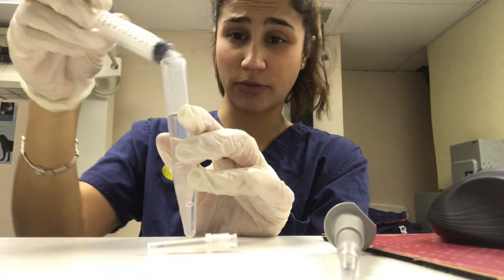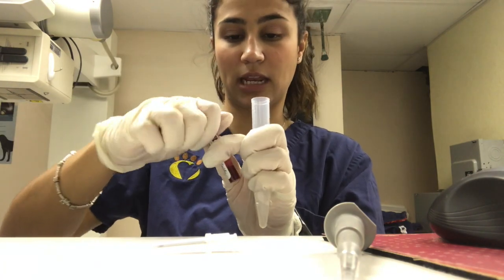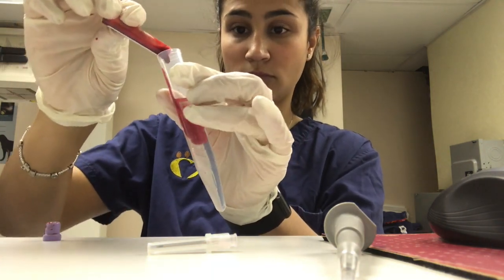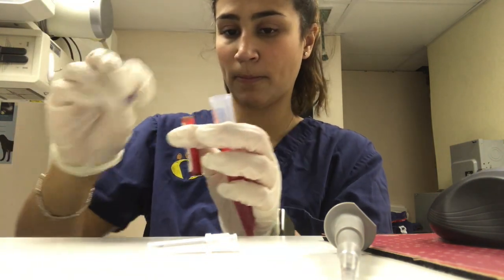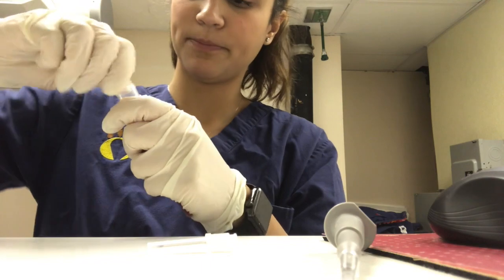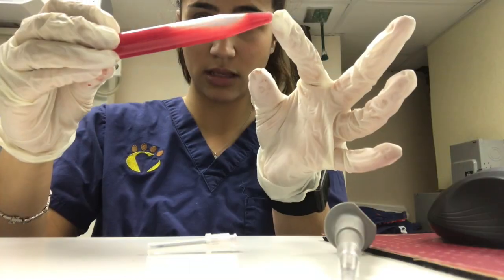Always be super careful with formalin, since it is a carcinogen, just like that. And then I will be adding our 1 mL of anticoagulated blood straight to our sample. Perfect. And I'm going to add our top so we can centrifuge it, but first I will be inverting it just to mix it. Okay, great.